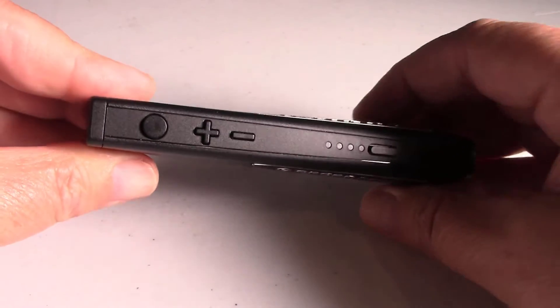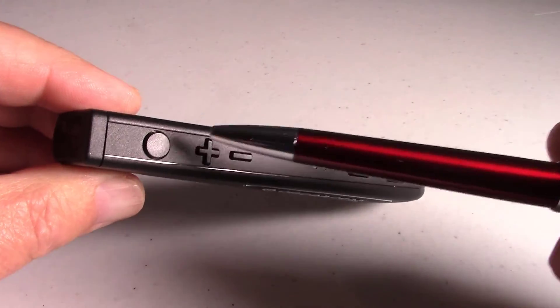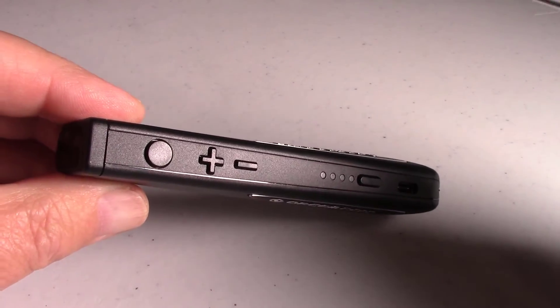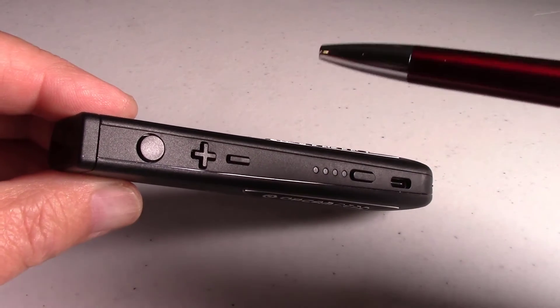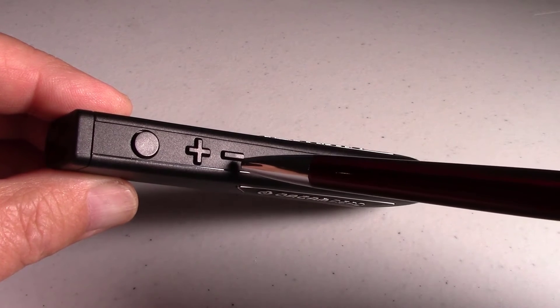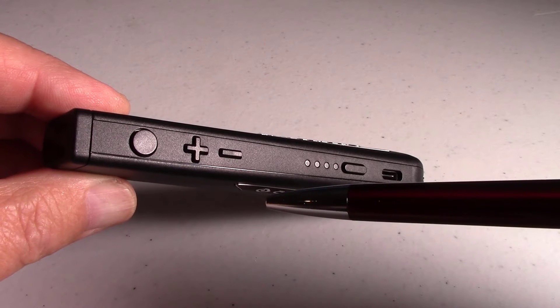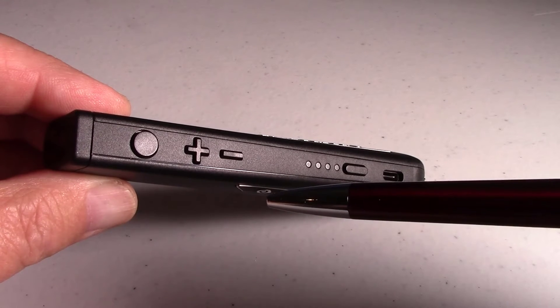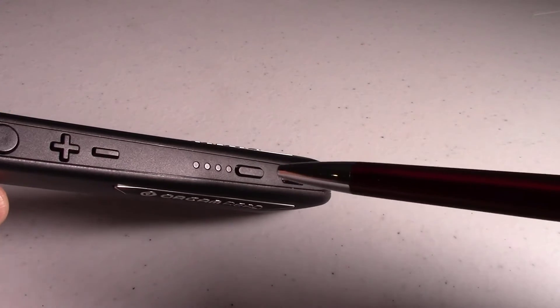At the top, this first button is called the trigger button. That's the one we push to take a picture of the text. We also push it again and it will stop the reading. This is the plus button, the minus, for volume up and down. As well as when we are reading, we can fast forward and rewind — push plus to go forward, minus to go back.